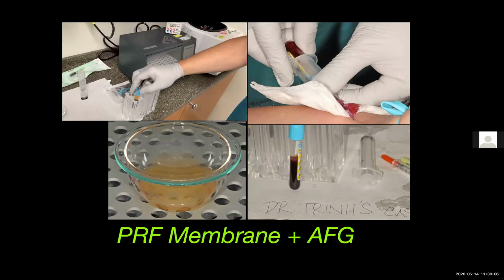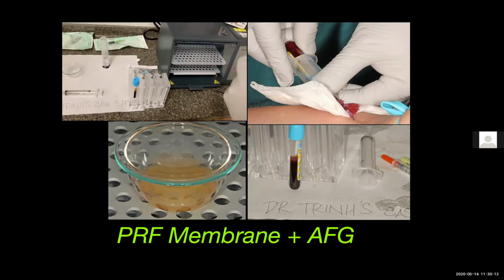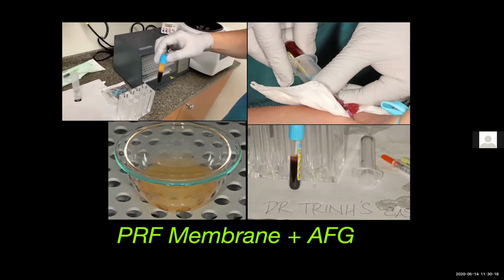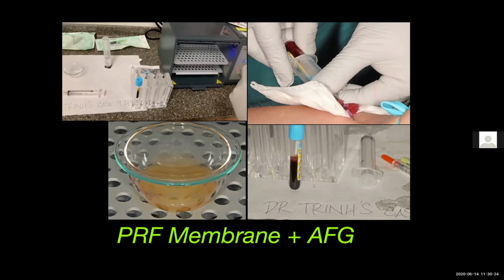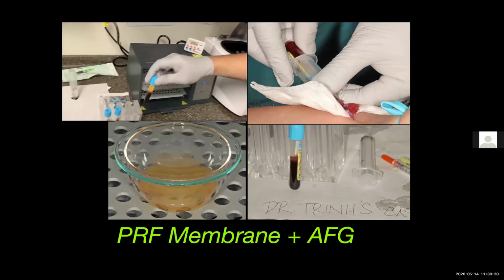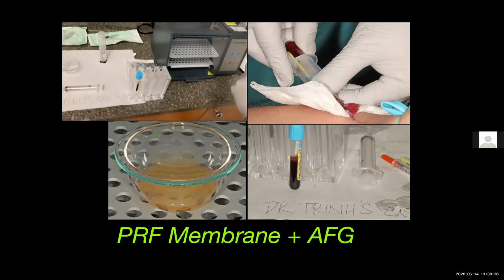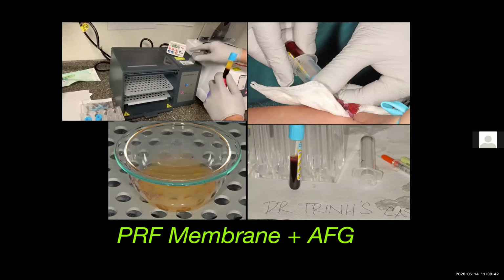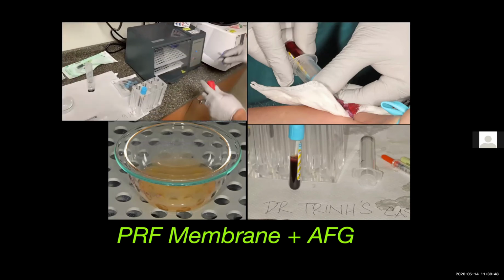Now, if you don't want to use a collagen resorbable membrane, the alternative is to use a PRF membrane, which is the platelet-rich fibrin membrane. It's made from the patient's own blood. You can also combine the liquid phase of the platelet-rich plasma with the bone graft material to make sticky bone, which makes it very easy for handling during the grafting. Using these techniques really accelerates the healing process. And Dr. Kim gave a great lecture talking about the use of PRF as well as AFGs a few weeks ago.